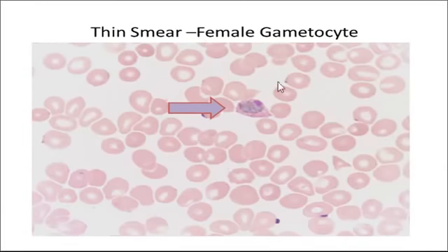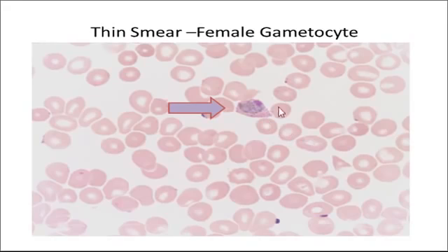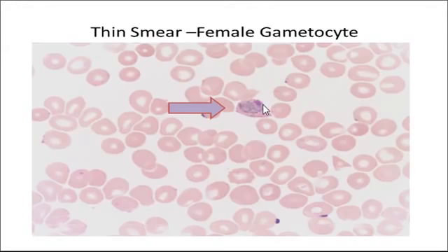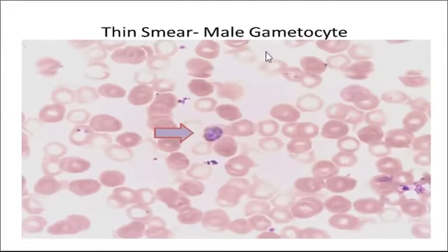This shows a female gametocyte. It is not really necessary to identify whether it is female or male in routine smear reading, but for educational purposes: the female gametocyte is also called a macrogametocyte. It has a round to oval cytoplasm and an eccentric chromatin dot — you can see the eccentric pink chromatin dot — and the round oval cytoplasm is quite evident. Schüffner's dots are also visible.